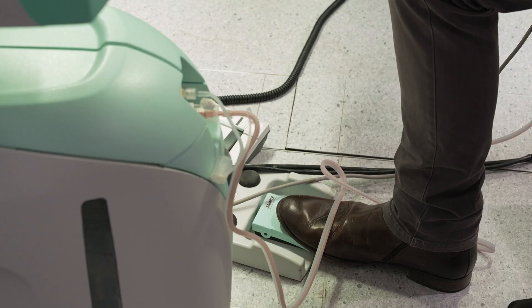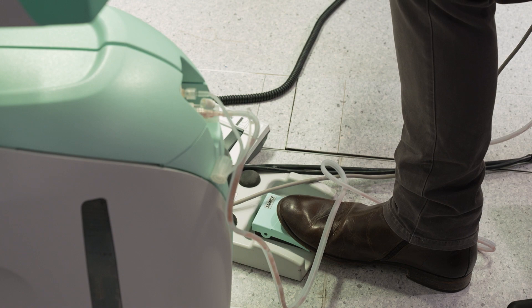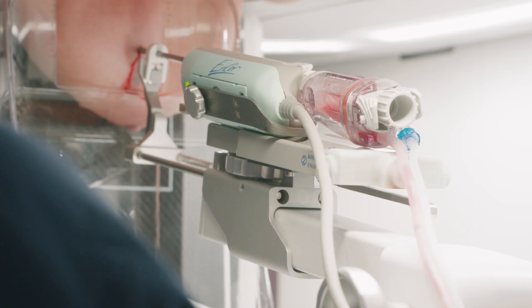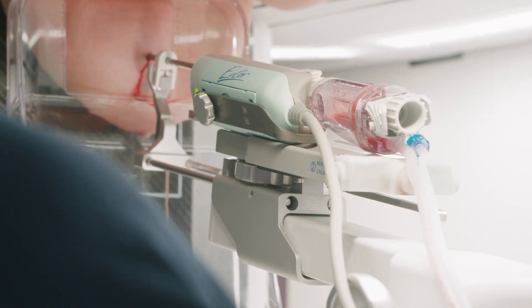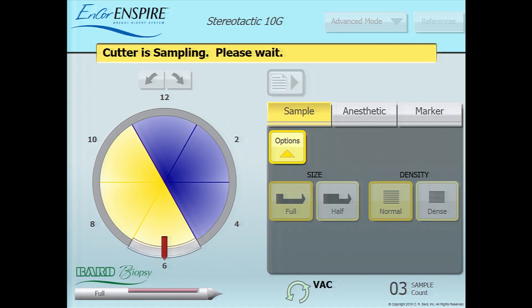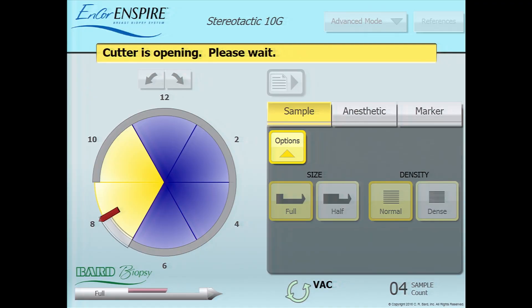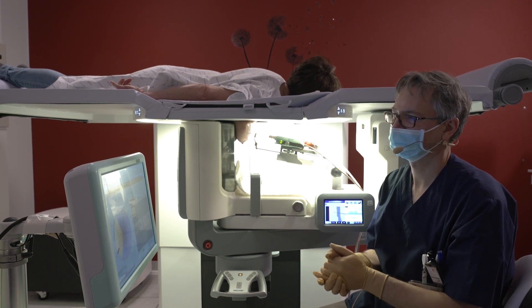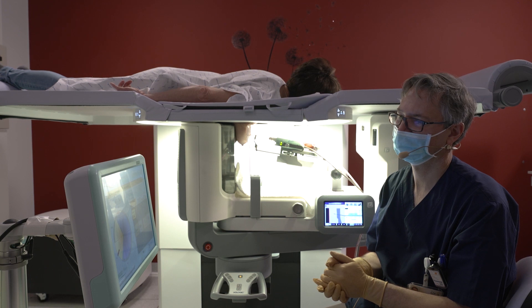The cutting of the Encore needle can be controlled by a foot pedal. Through a lateral opening in the needle, samples are taken in a circumferential way. The samples are collected in a collection chamber at the backside of the needle. We take 2 rounds of 6 samples each. At any time, the position of the cutting device can be controlled on the screen of the Encore breast biopsy system. During the procedure, it is important to maintain contact with your patient and reassure her that everything is going well.